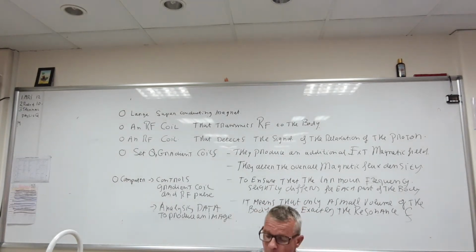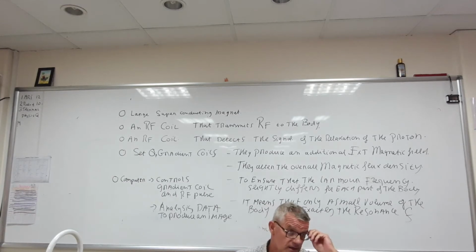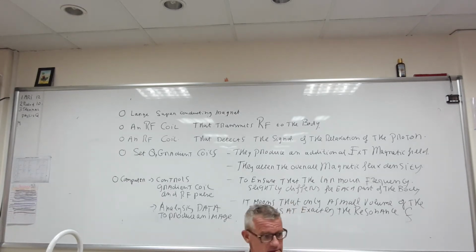Now, I want to discuss with you a little bit about the procedure. Well, the patient lies in the bed. It's moved into the center of the electromagnet, and each section is being scanned, yeah? The magnetic field is very uniform and with some variations, as I told you, okay? Then the gradient field is superimposed on this fixed field.